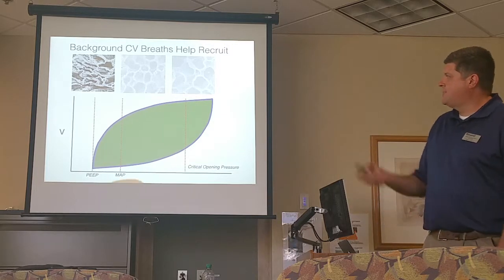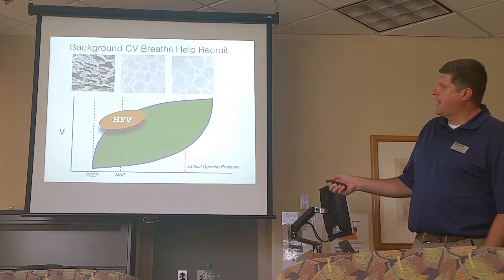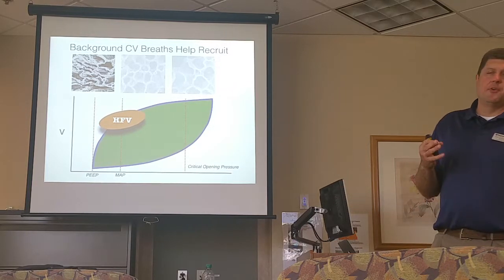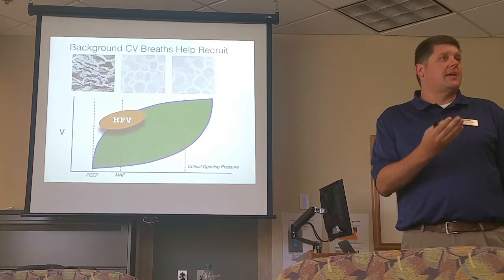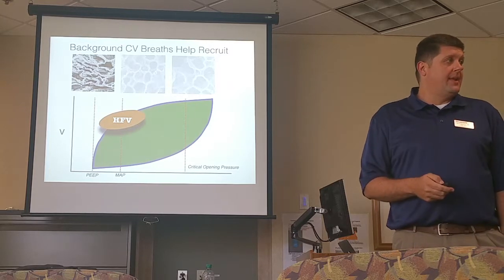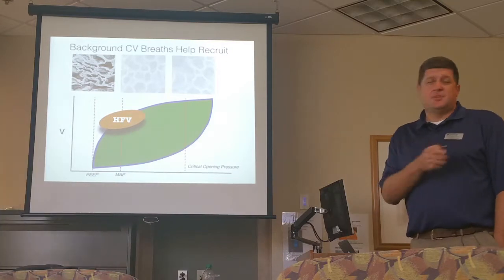And if I could simplify it optimally, this is where high frequency would like to hang out, just where the bottom part of the delta P is just at or above your PEEP level. Well, if I have atelectasis, a lot of times we just turn PEEP up. Well, that's true, but sometimes it's not always the right answer, especially when it comes to using it with the jet.